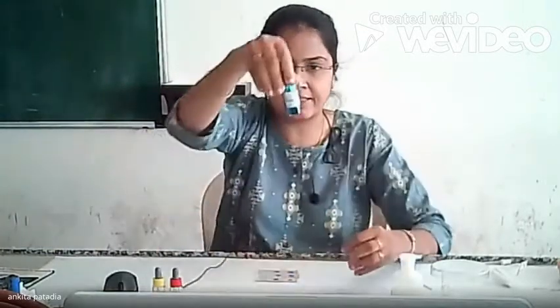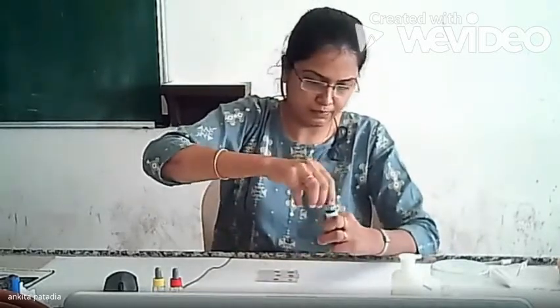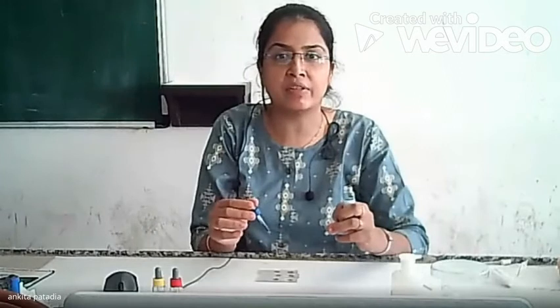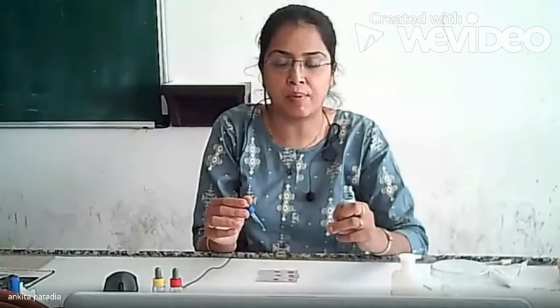Now, this is antisera A. When you are adding antisera, be careful, add it with a distance, don't allow it to touch the blood drop.